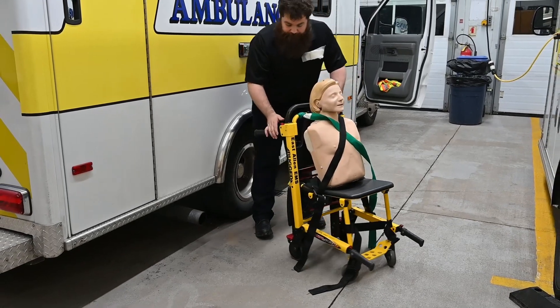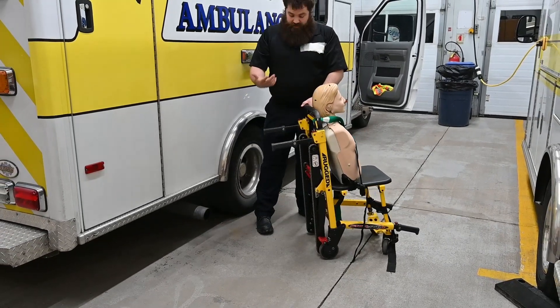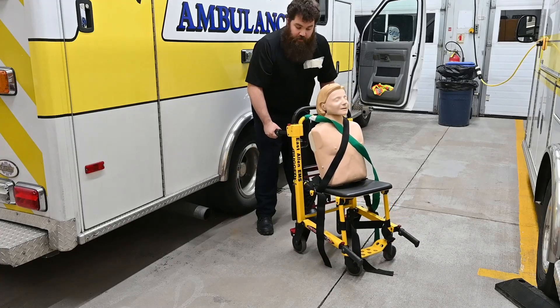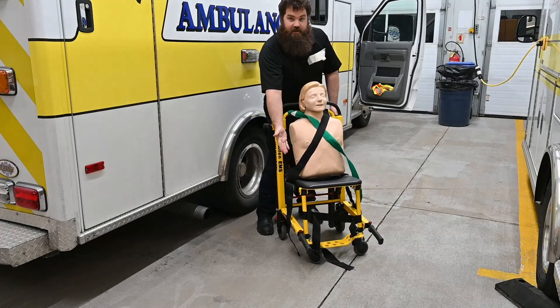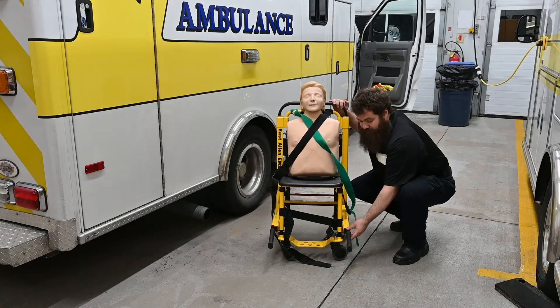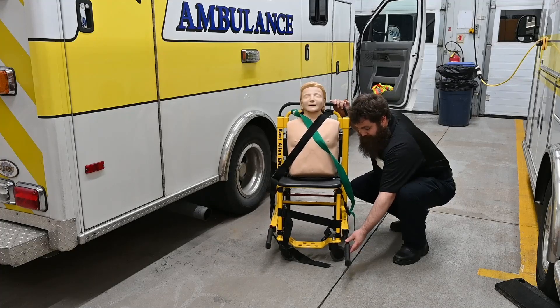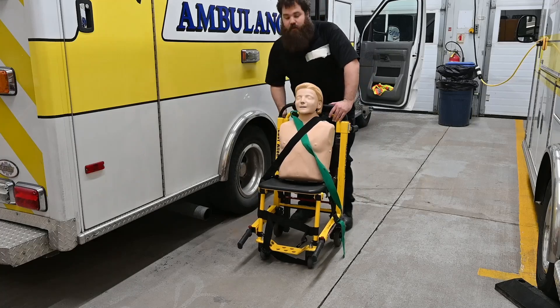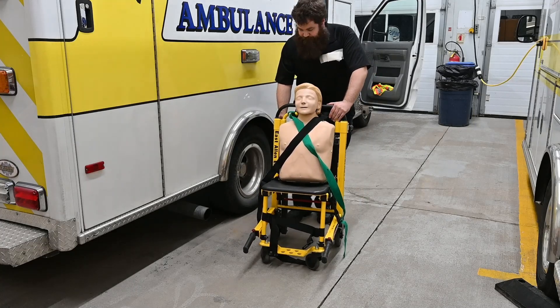When we come to a set of staircases — any set of stairs or steps — if we're not going to physically pick the patient up using these handles, you'd have a helper at the front with the front handles by the feet. Those front handles come in and out with the push of a button. So when we come up to that staircase and need to get the patient down, what are we going to do?